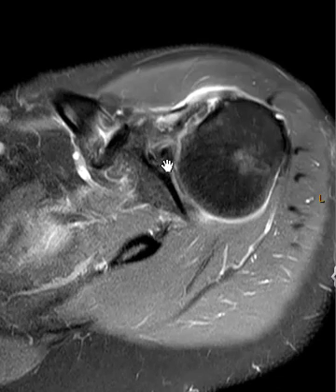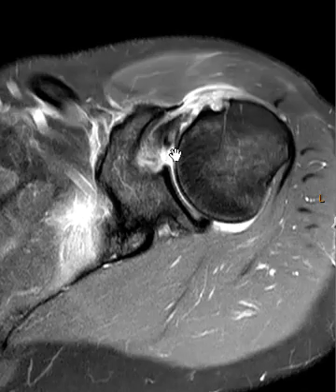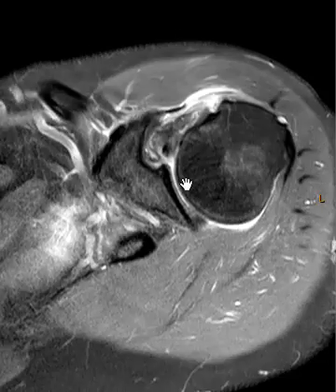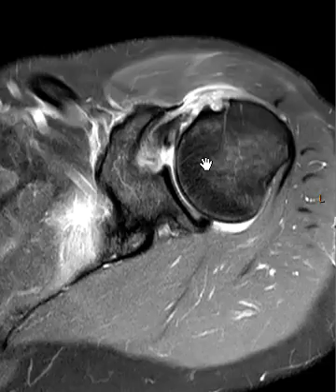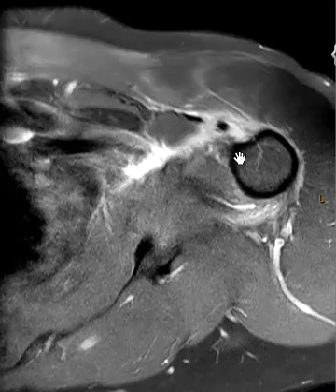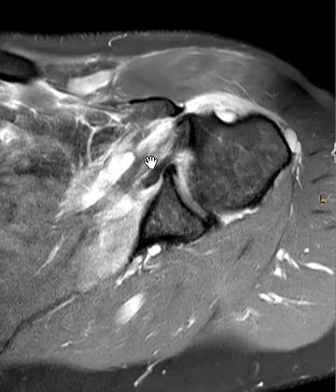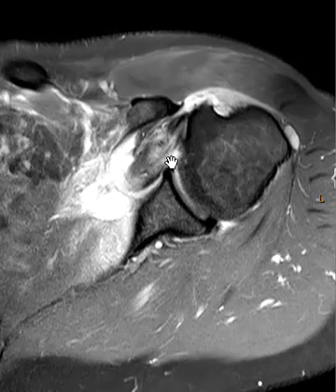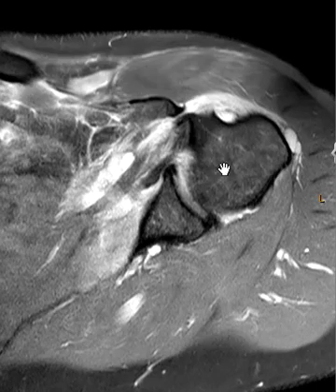There's the biceps tendon — here's where it comes off the top of the anterosuperior labrum at the labral anchor complex. Going forward we see the biceps tendon with that bright signal right in the middle of it — a little longitudinal intrasubstance tear or tendinopathy. It looks a little attenuated here but it's not ruptured. You can see how it's dislocated immediately. So remember: when you have a torn subscapularis tendon, the biceps tendon will often immediately dislocate like this. Thank you very much.